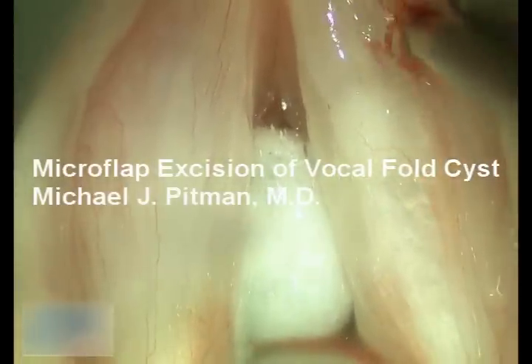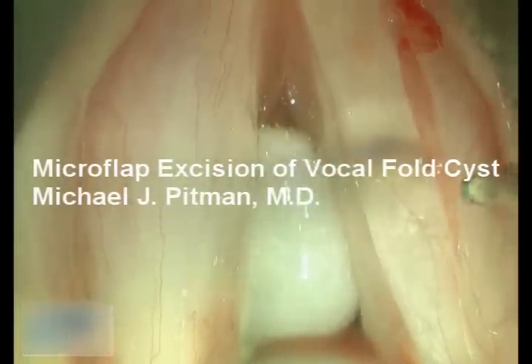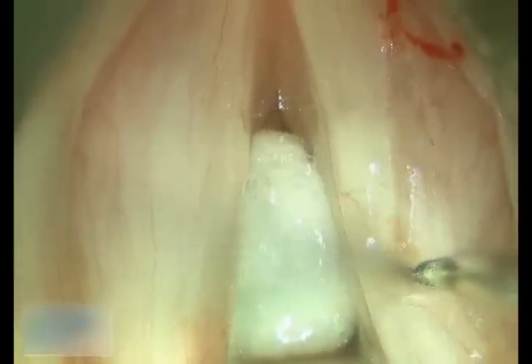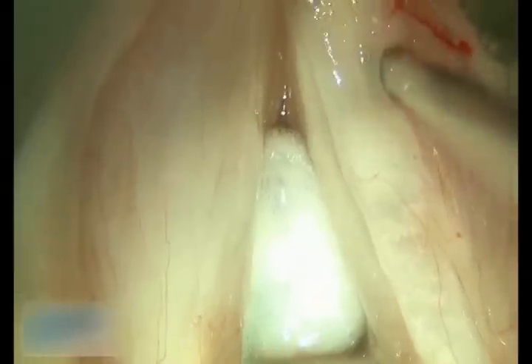This is a two-minute video of a 45-minute microflap excision of a vocal fold cyst. You see the cyst in the mid-membranous vocal fold. The cyst appears as an ovoid white intracordal mass.